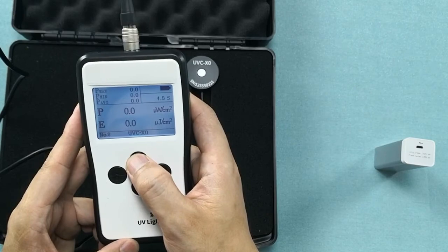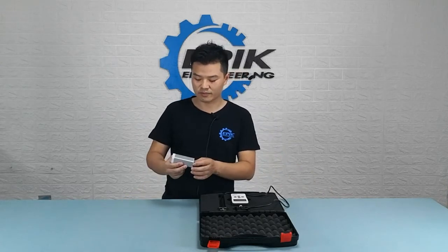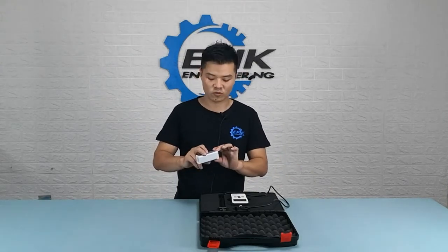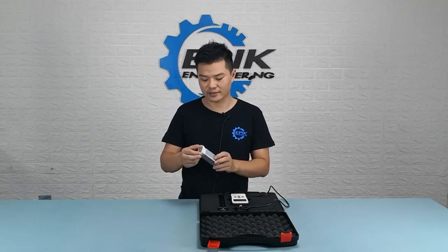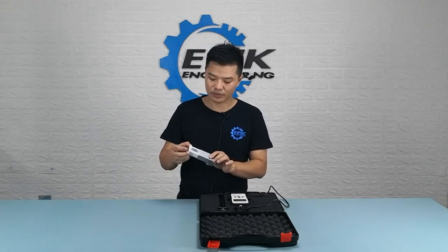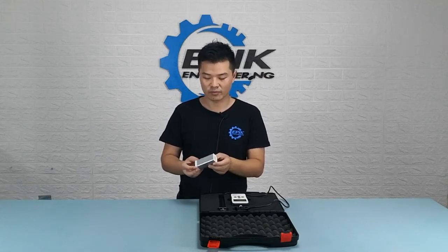This device allows you to store 9 sets of data, which is super convenient if you want to keep track of the data and compare them later on. To demonstrate, I'm going to use this pocket size UVC sterilizing wand. This sterilizing wand has two lights: a UVC lamp on one side and an LED on the bottom.